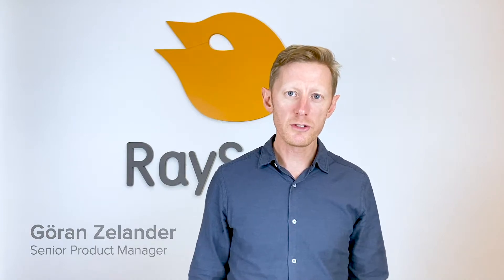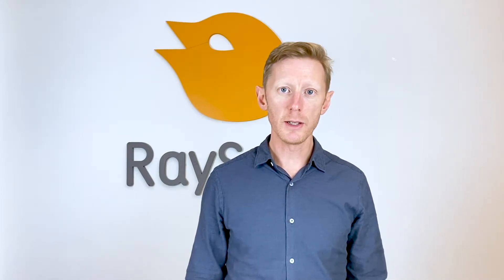Today we will talk about the light sensor of the Raysafe X2 meter for quality assurance and service of diagnostic x-ray equipment.